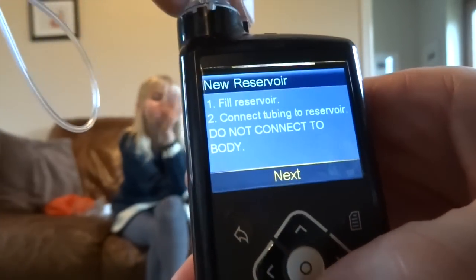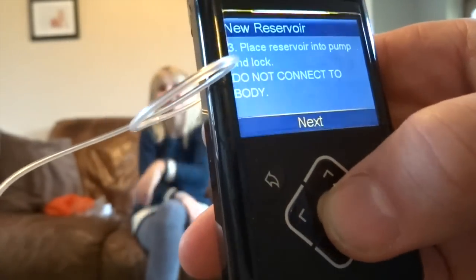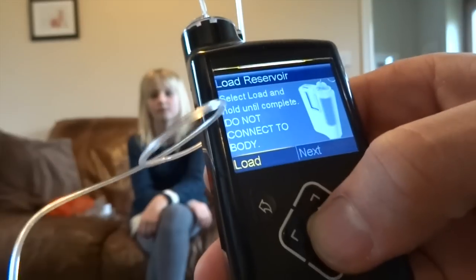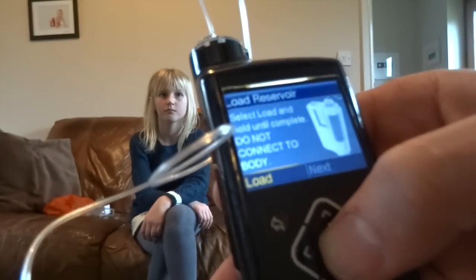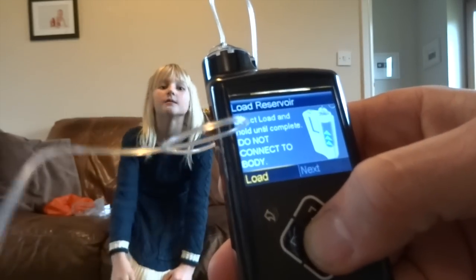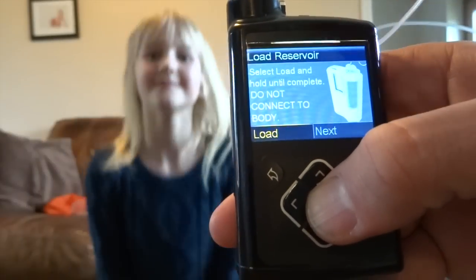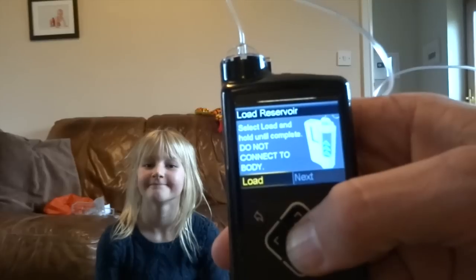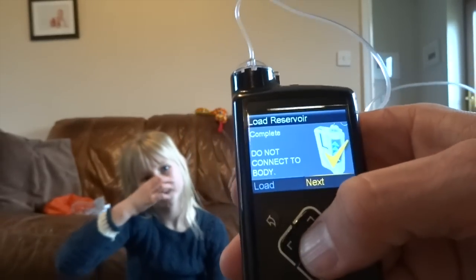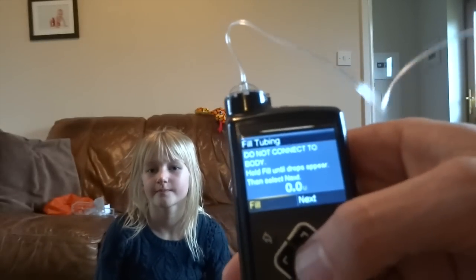Fill reservoir, which we've done. Connect tubing to reservoir — do not connect to the body, which we haven't done. Place reservoir into the pump, which we've just done. Click Next. Select Load and hold until complete — do not connect to the body. The plunger's now going up to the level where the insulin was. Load Reservoir — do not connect to the body. Next. Fill Tubing — do not connect to the body. Keeps telling me don't connect to the body. I'm getting the hint. So we click on Fill.